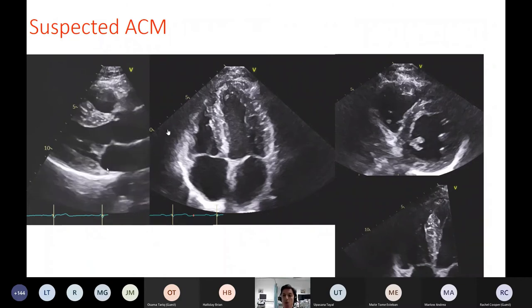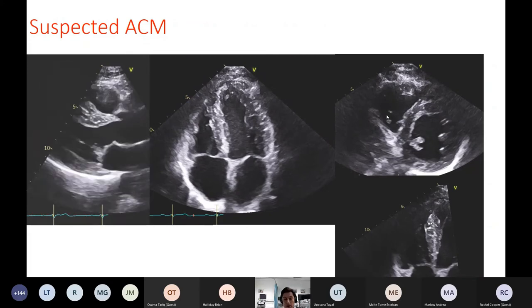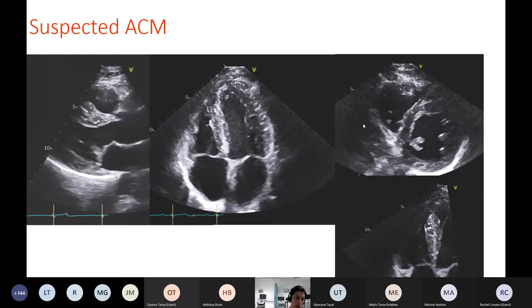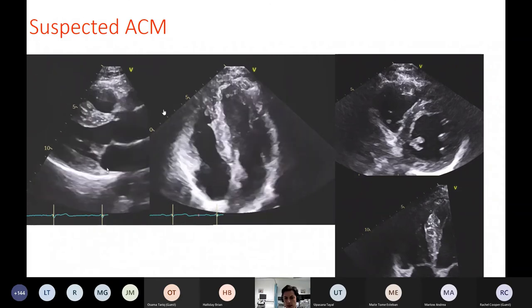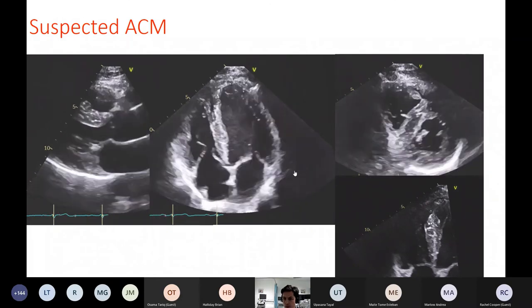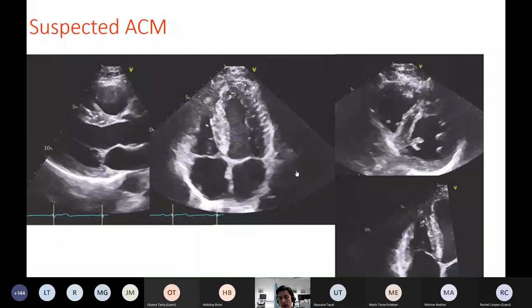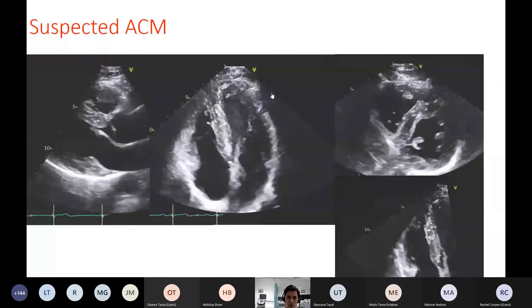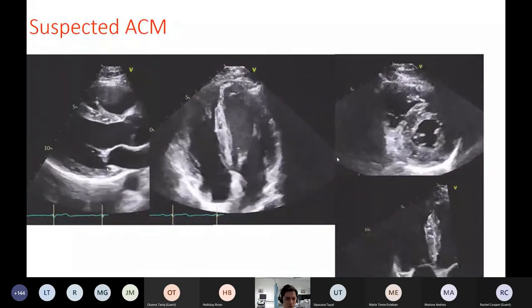So this moves on to the arrhythmogenic cardiomyopathies. So new RV guidelines are much more generous and now differ quite a bit from the task force guidelines. And we do know that arrhythmogenic cardiomyopathy is a biventricular process. So what do we think about this case here? So this is a young man with a history of chest pain, anterior T-wave inversions, and a previously normal MRI. Now, to me, it all looks pretty normal, except maybe the inferior free wall from the short axis view. I don't know what you think.